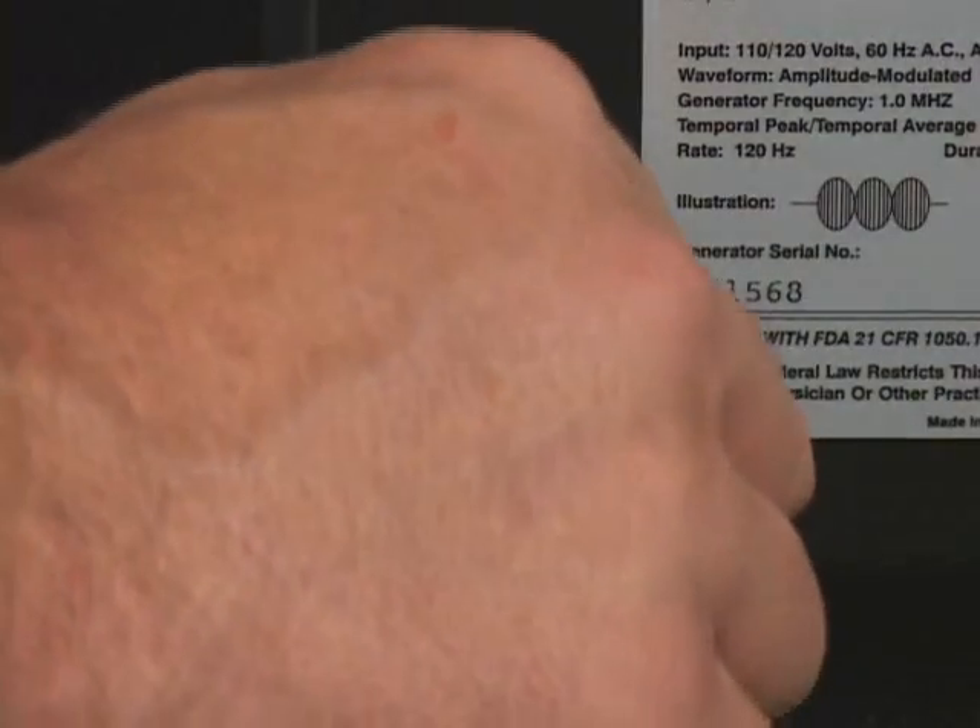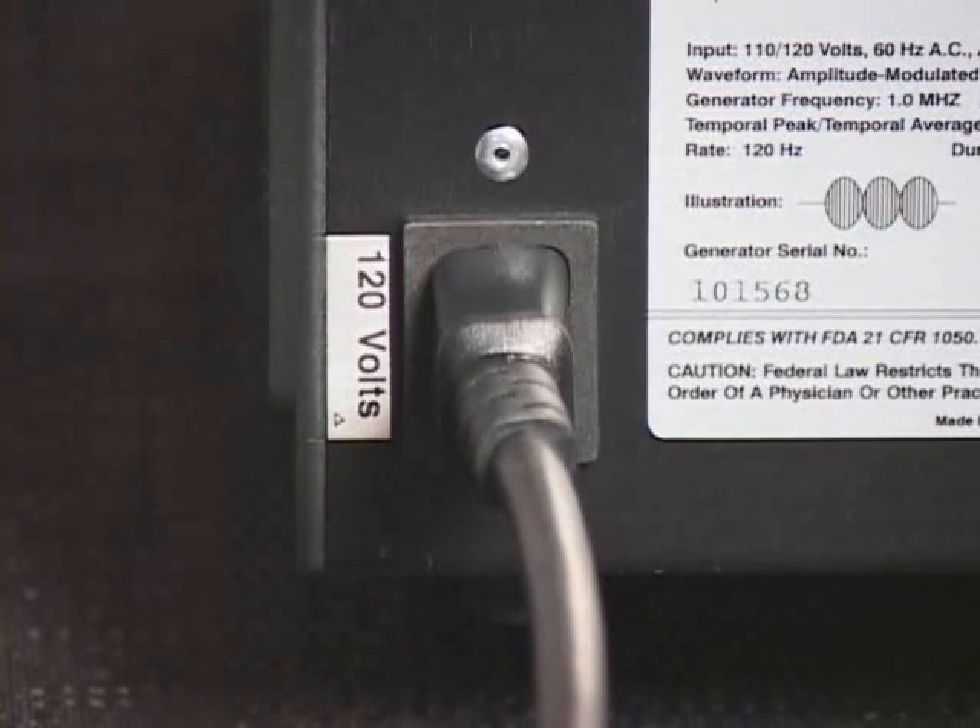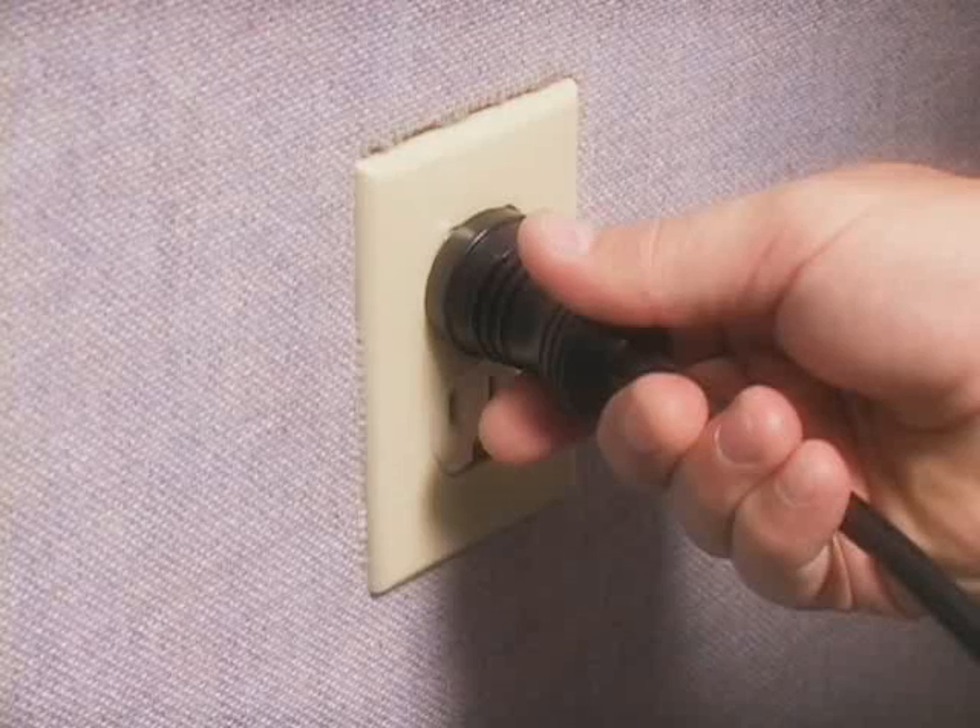In order to operate model MS-324A or MS-324AB, you must first connect the power cord to the AC receptacle on the back of the unit and insert the power cord plug into a properly grounded AC receptacle.